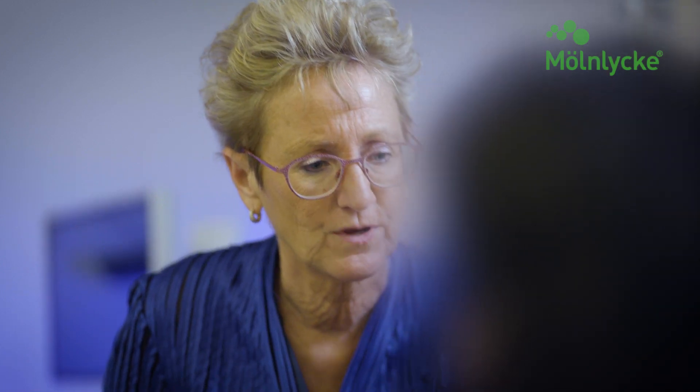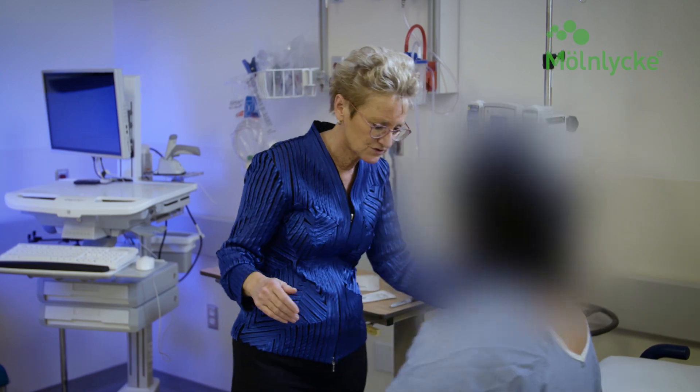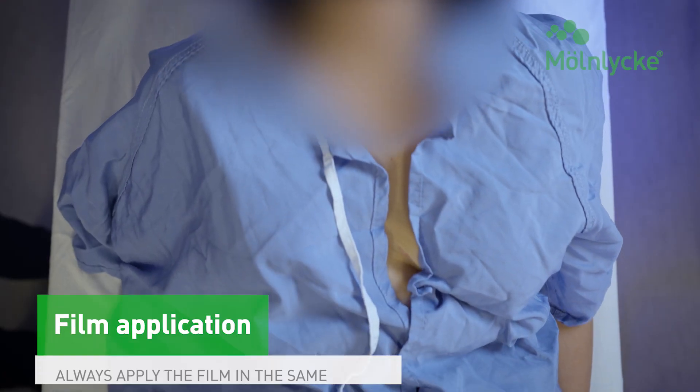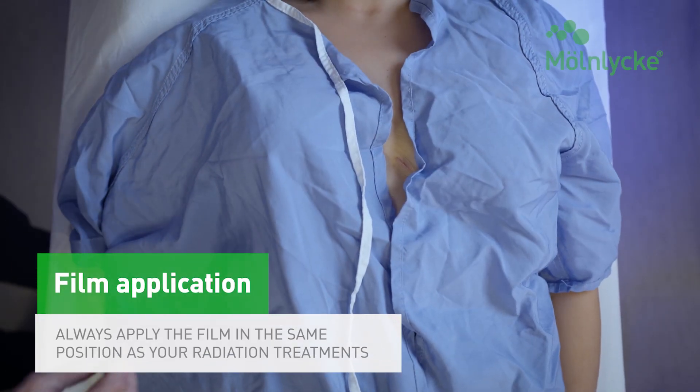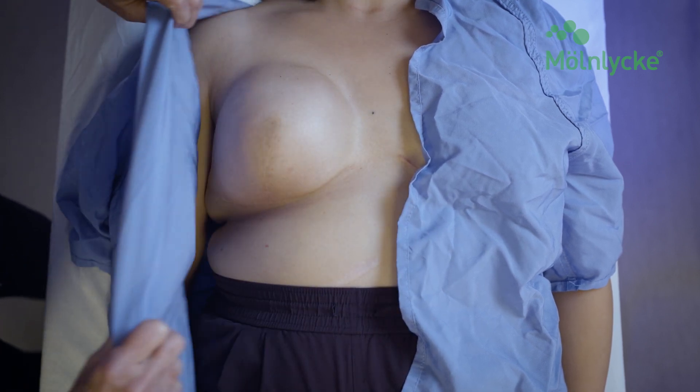To begin, have the patient don a gown with the front open. Ask the patient to slip their arm out of the gown to facilitate easy access to the full radiation treatment site. Then place the patient in the position needed for radiation treatment — this is generally supine with the arm raised above the head.